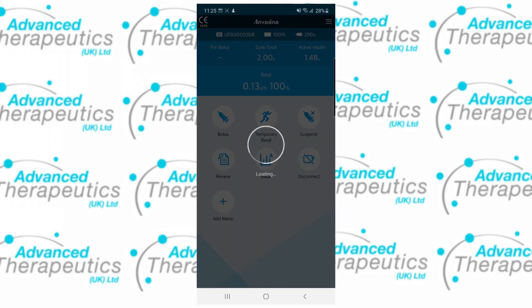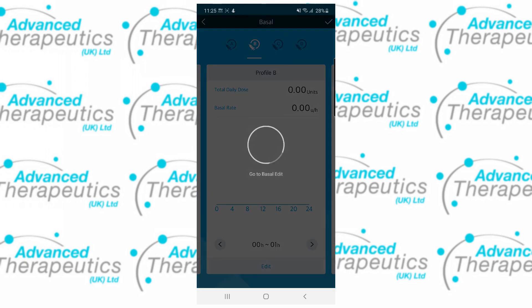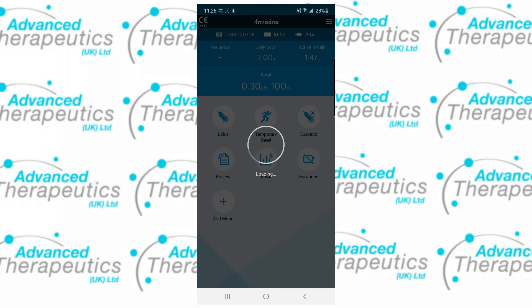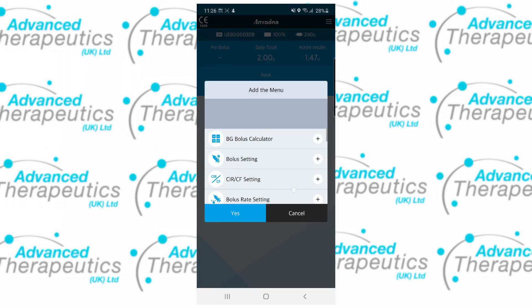The basal option on the home screen gives you quick access to your basal rates and allows you to swap between profiles very quickly. The disconnect option on the home screen will disconnect you from your pump, and the add menu option will allow you to put quick shortcuts on the home screen to places you might visit often, such as the BG bolus calculator.